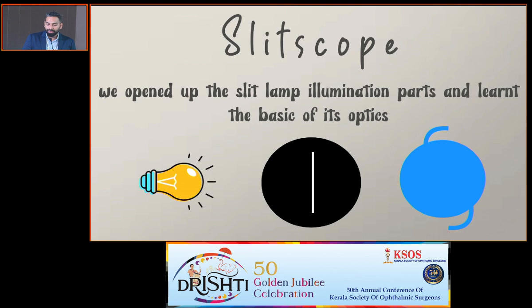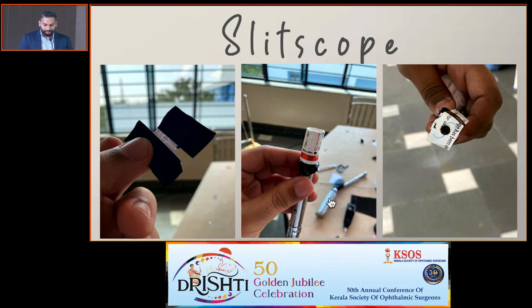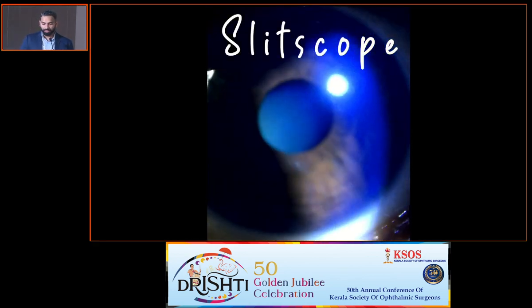So over here we use the IOL again. So over here we can see how we use the opaque substance as a chart paper, and then we put it on a torchlight and an intraocular lens. I think it was a 23 diopter lens which we used first. This was the first time we tried this, and like you can see there was a slit. So we used a moon shaped torchlight. That is what we get on Amazon for around 200 rupees.